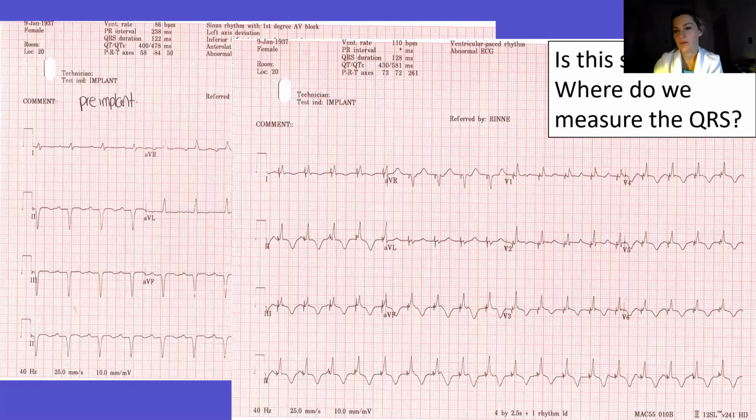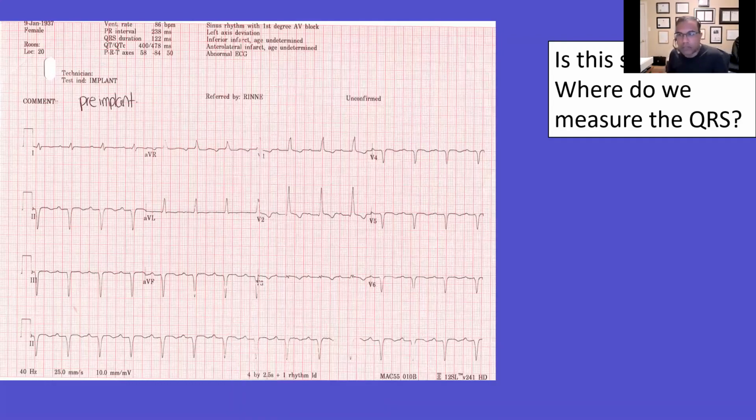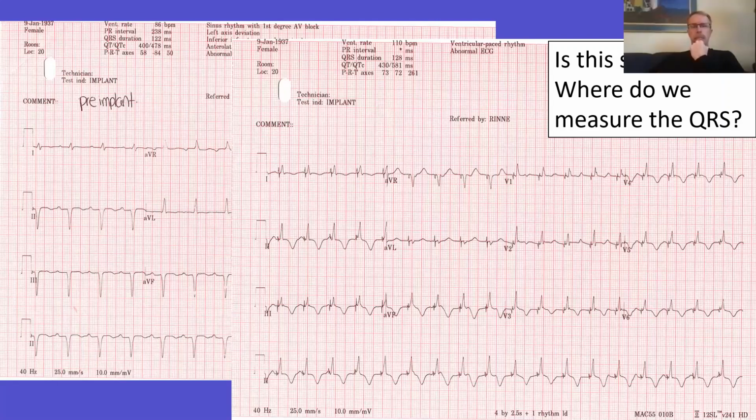Atul, what do you think? Where would you measure? Well, the classic papers have all left out the latency, right? So they're measuring the QRS duration minus the latency. The way we report it in our database is we report a latency and then we report a QRS duration. I agree that when you measure the QRS duration on the ECG, it's everything after the spike, so it includes the latency. If your latency here was, and I'm just eyeballing it, maybe between 20 and 30 milliseconds, then your QRS duration would probably be about 100 milliseconds.